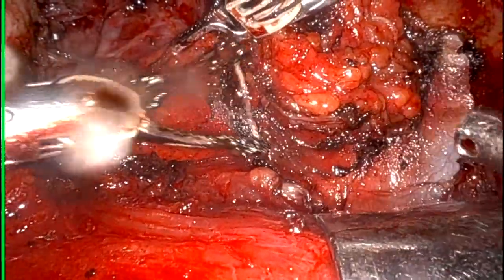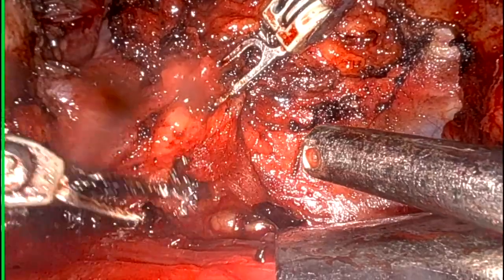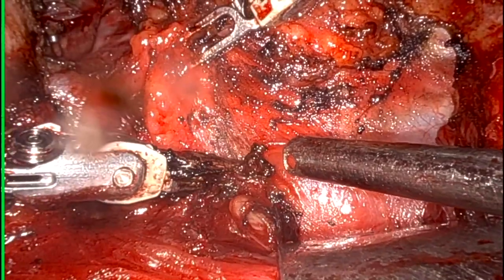You can see a few nodes. IJV is better visualized now. And we have lifted the entire tissue of level 2A and 3 medially.